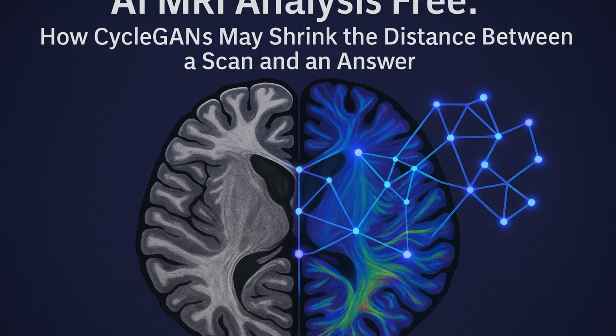Each part trying to fool the other until the fakes look real. That's the core idea of GANs, generative adversarial networks, these competing AIs. Right, GANs. And the cycle consistency loss is another clever bit. What's that do? It makes sure that if you start with T1, use G to make an FA map, then use F to go back to T1, you should get something close to where you started.